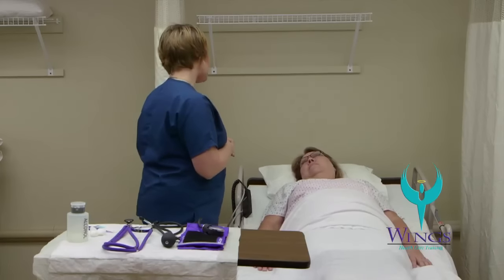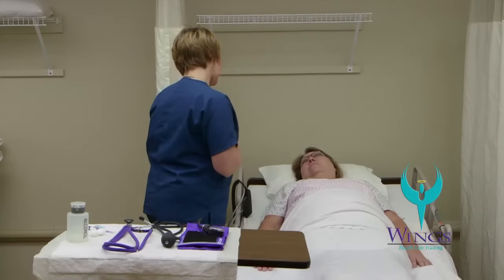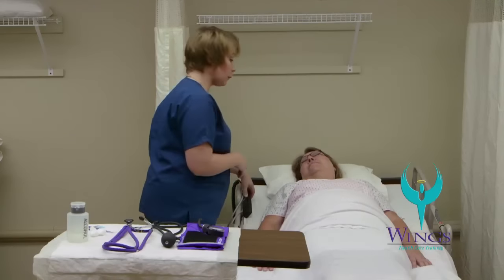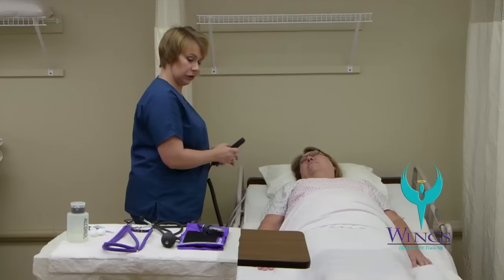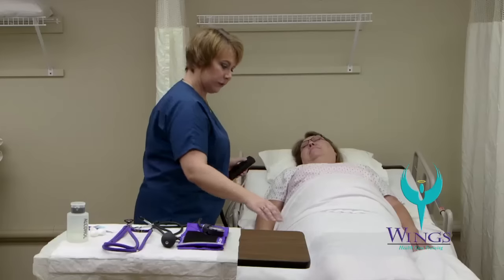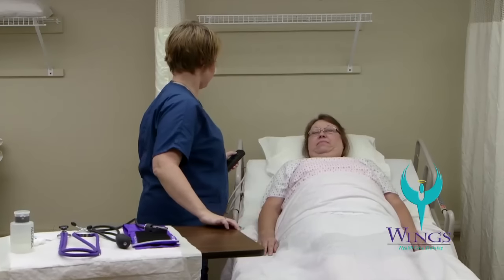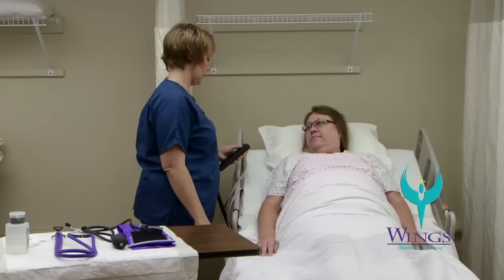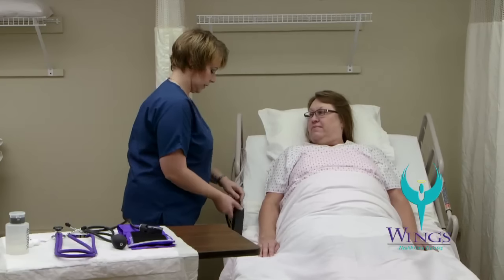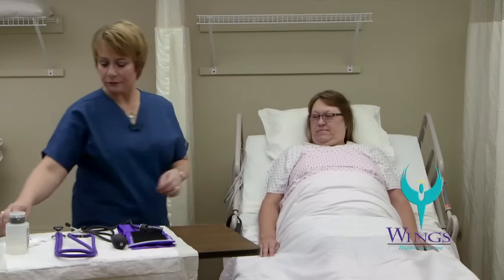Hi Beth, my name's Mari, I'm going to be your aide today. How are you? I'm good. I'm here to check your vital signs, okay? The first thing I'm going to do is raise the bed up to a good working level for me. I'm going to raise the head of the bed.